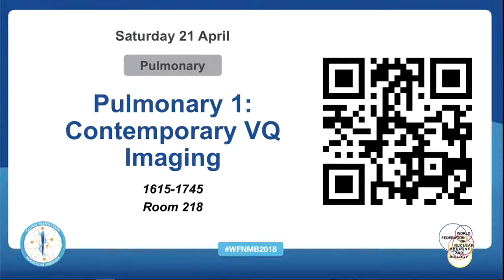Thanks. Sorry, can I just make a comment? I always do a dynamic study when I do the perfusion injection, and so you can see the main pulmonary artery. So if there's a clot stuck there or in the right ventricle, you can see it. And this has happened once in my career, so it is very rare. If you have evidence, I haven't read the evidence, but I think it sounds like a very good idea.